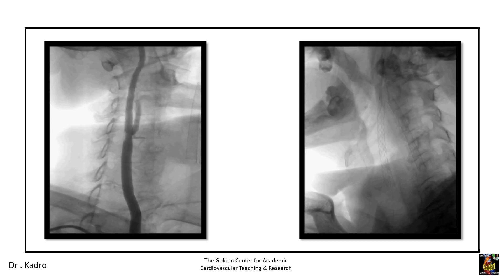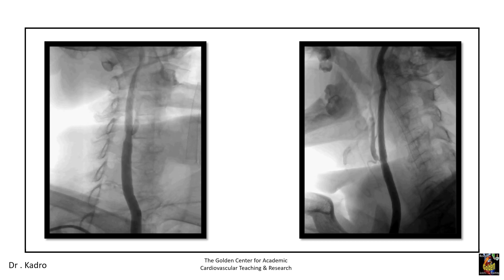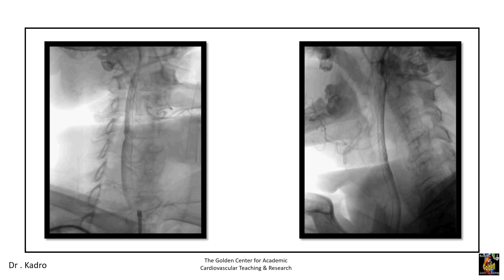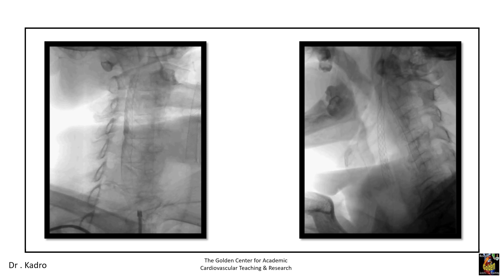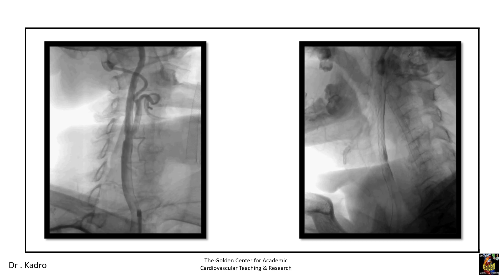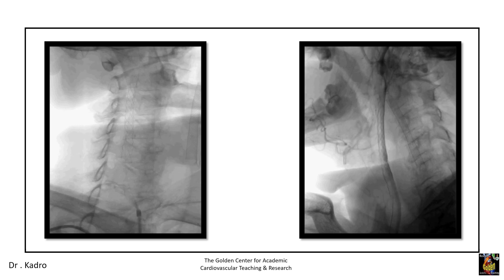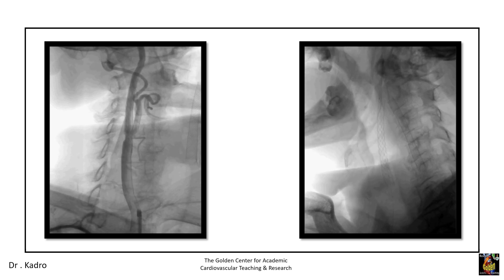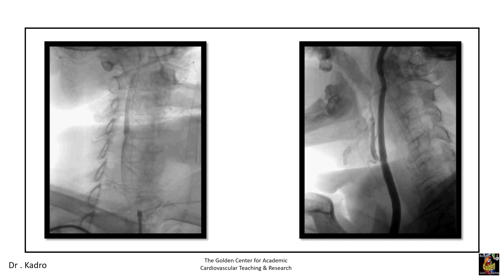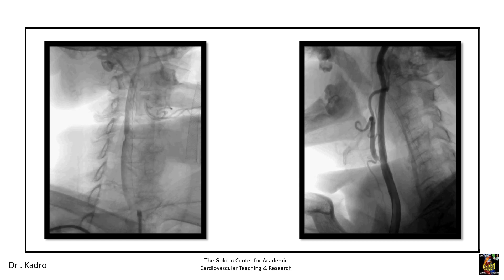This is the final angiogram showing minor residual stenosis, attributed to a large calcium nodule at the end of the common carotid artery. However, good lumen was achieved in the internal carotid artery. This is another view after removing the filter wire, showing good lumen in both the common carotid and right internal carotid.